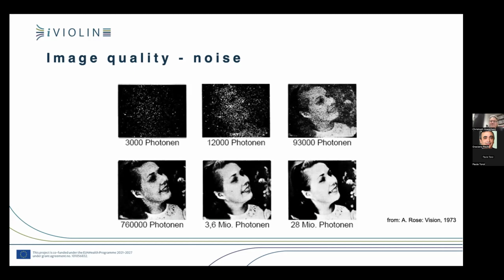If I tell you the nuclear medicine guys, they use an image with that kind of signal-to-noise ratio, which is the middle of the upper row. And so they live with much more noise, but well, they also have some advantage, right? They only look for the function, so they don't need to really see every detail of that. They just need to see where it is shining up.